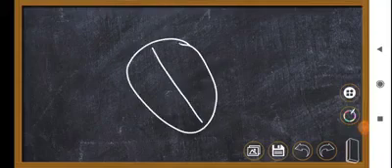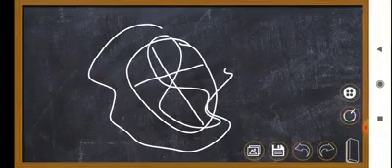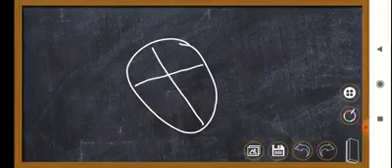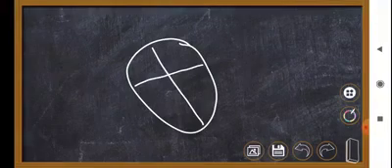Suppose this is a heart and we have to look at all the electrical activity occurring inside it, right? So we must have different eyes at different places to look exactly at what's happening and where it is happening.